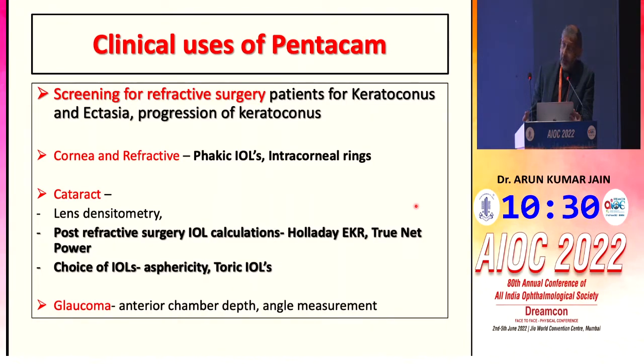It also has applications in planning phakic IOLs and intracorneal rings, and in cataract surgery, lens densitometry for knowing the hardness of the cataract, as well as post-refractive surgery IOL power calculations and choice of IOL, which type of aspheric or toric IOL we can choose based on the Pentacam findings.